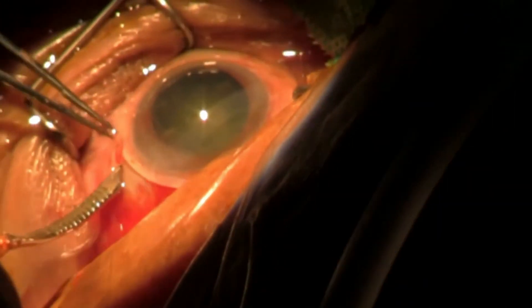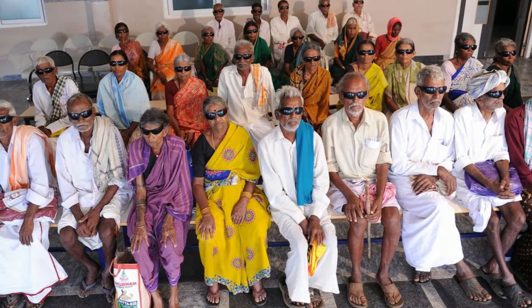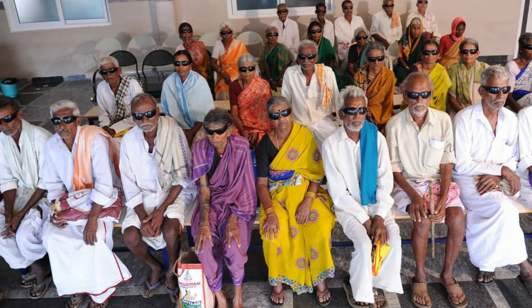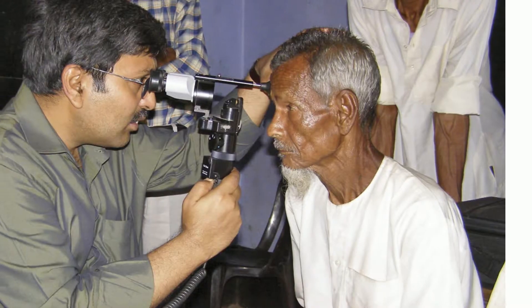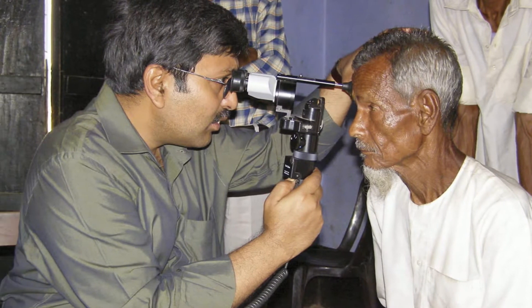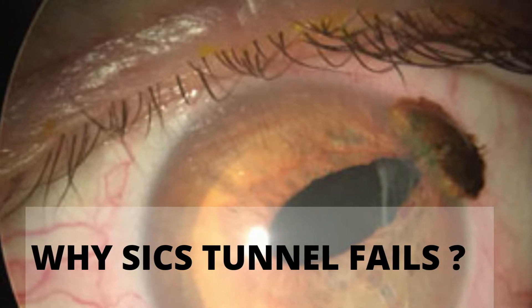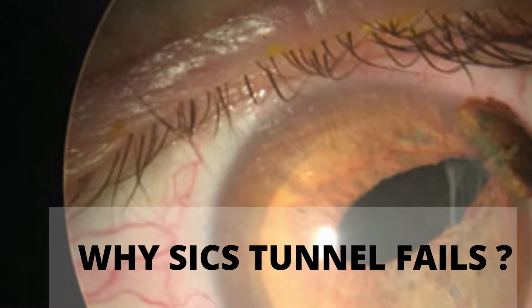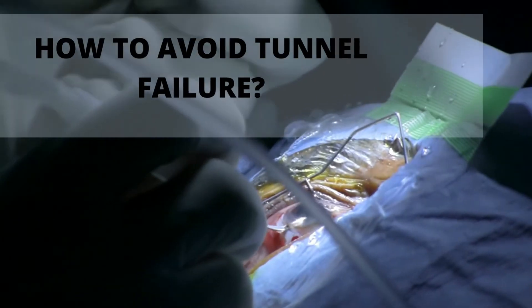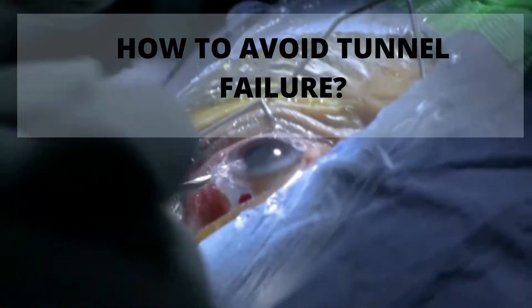Small incision cataract surgery is a common cataract surgical technique, useful for high-volume cataract surgery. Unfortunately, around two out of 100 patients have complications, which means they are left blind after the surgery. Improper tunnel construction is often the reason for poor surgical outcomes in small incision cataract surgery.